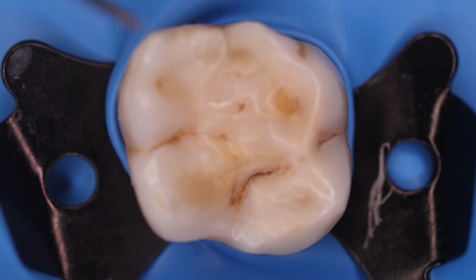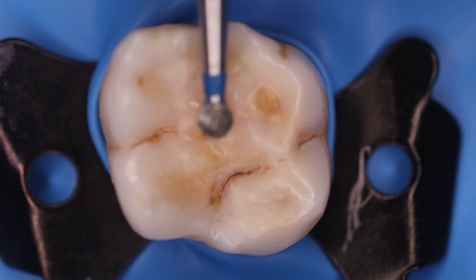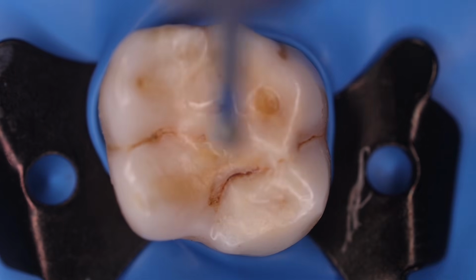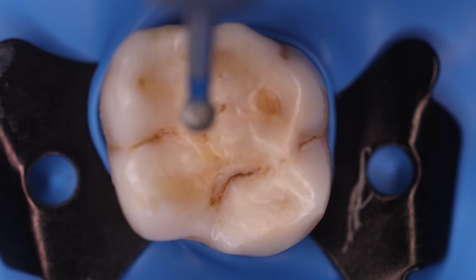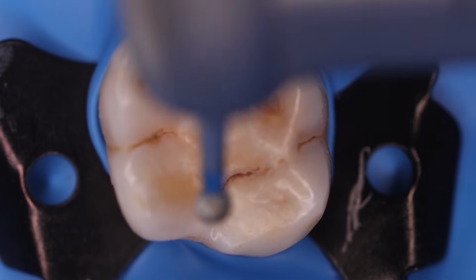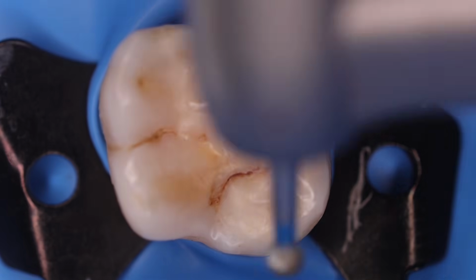So the first thing to begin with is a round diamond burr, a big round burr that would be used to make the initial punch as well as define the access cavity shape. Remember that we need to form the access cavity as per the outline of the tooth.